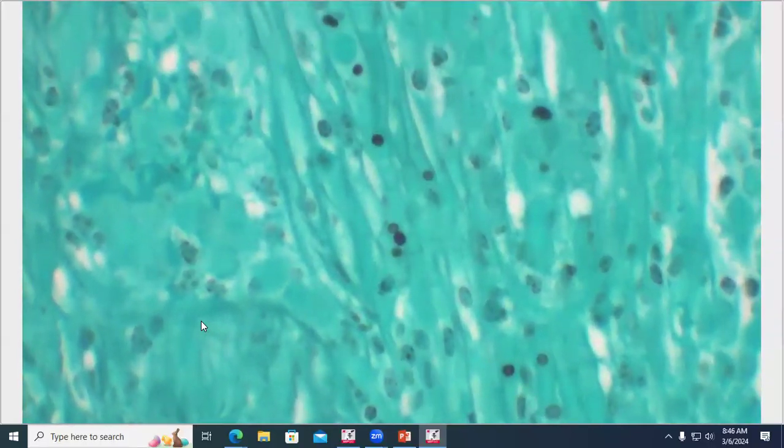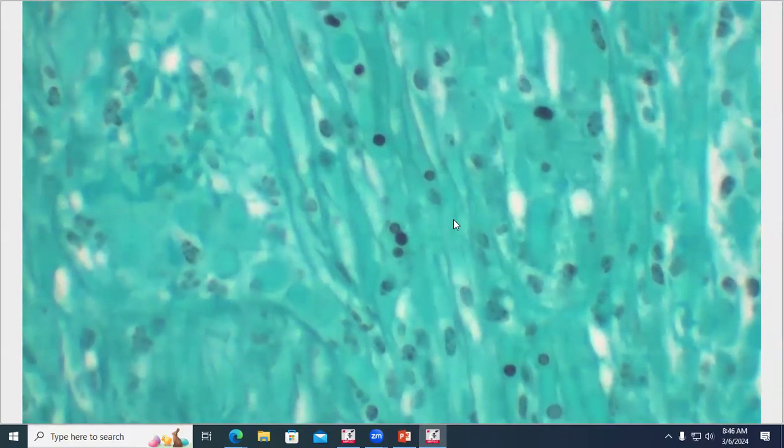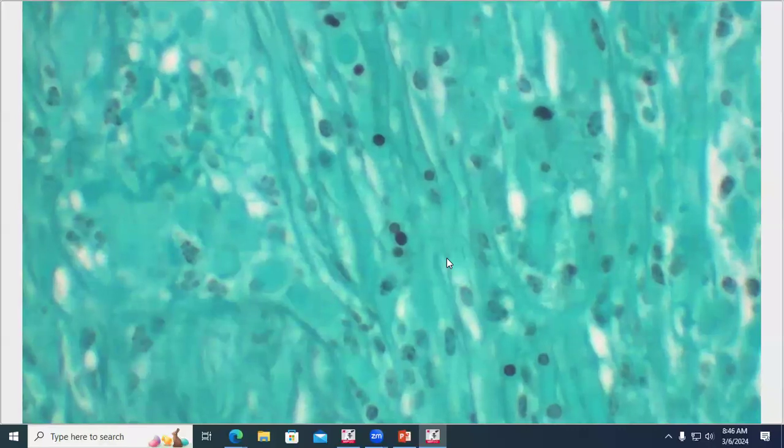This is one of my favorites in this case, because we do have a pair here that are budding, which is very cute. And it is theoretically narrow base budding, although we were actually discussing with this case that it can be kind of subjective, the budding. That budding looks narrow. It's like a bowling pin. Sometimes when there's like two budding pairs, they look like Mickey Mouse ears to me. But anyway, there's just one in this case. They're just reluctant to separate, they bud and like need to go on their own now, and they're like, no, stay here.